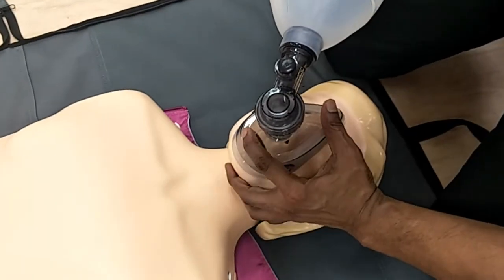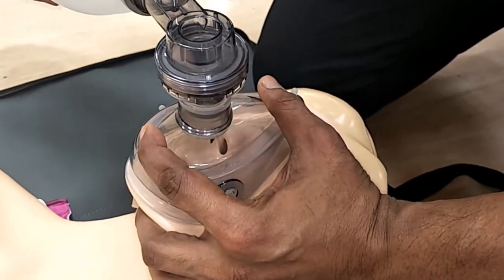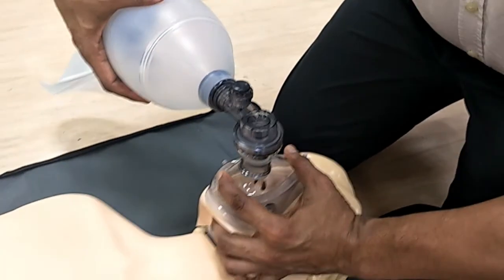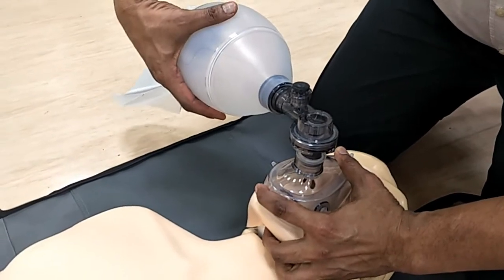Apply the mask to the face. Hold the mask in a C-clamp. Place your thumb and index finger on top of the mask. The other three fingers should grip the jaw to perform a chin lift or thrust. Clamp your fingers together to ensure that the mask has a good seal over the face. Squeeze the Ambu bag while ensuring a good seal with the mask.